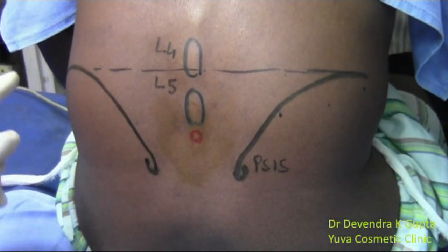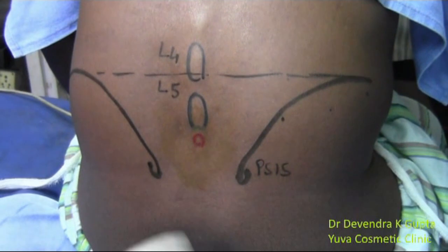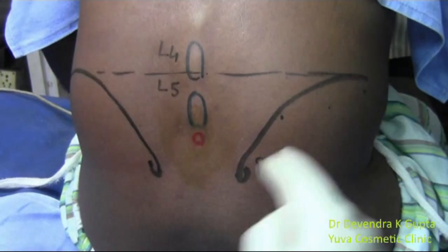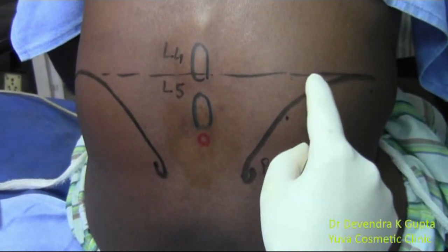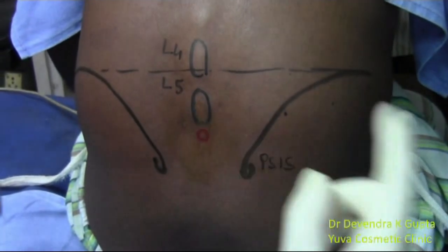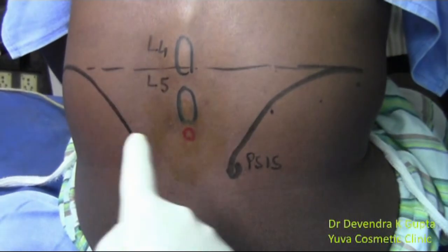I have marked the top of the iliac crest and the posterior spine, and I have made two curved lines here. The top of the iliac crest is joined by a dotted line, and this line passes between the L4 and L5 spinous processes. I am going to enter the needle just below L5.